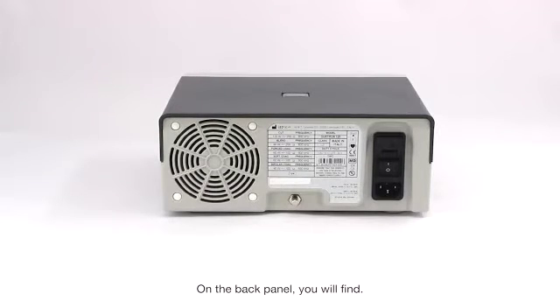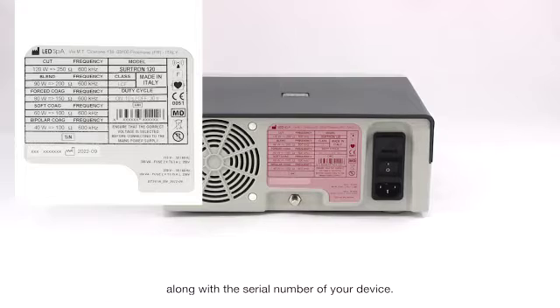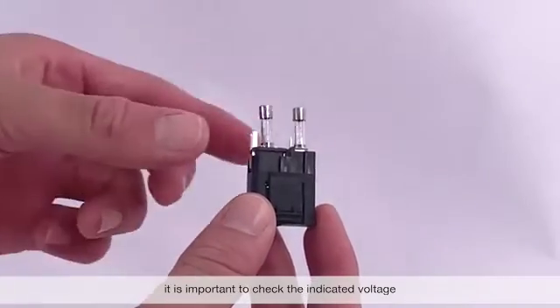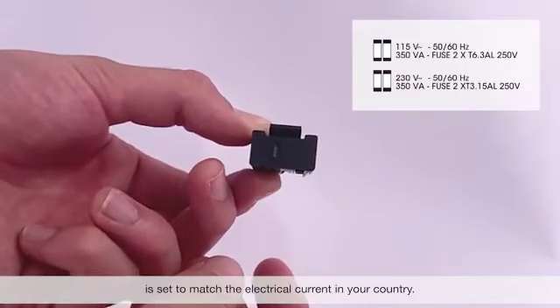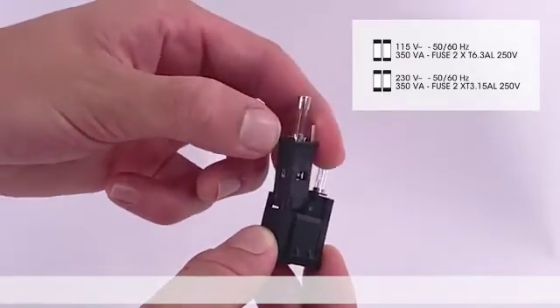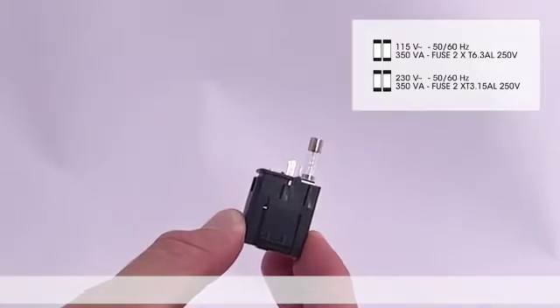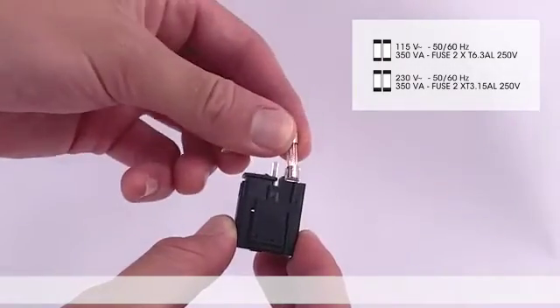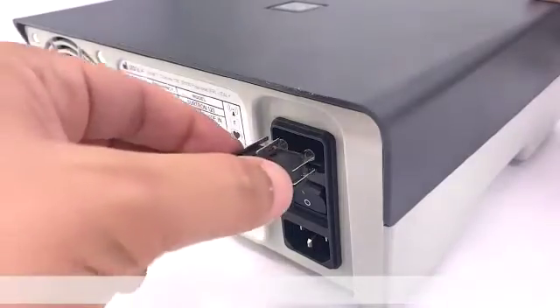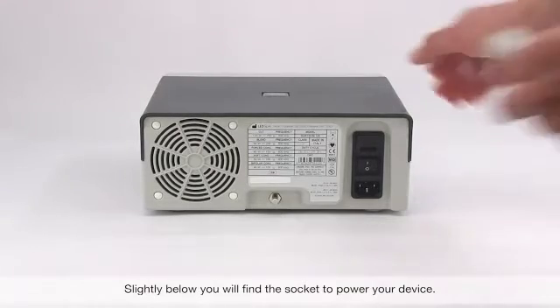On the back panel you'll find the white label with the max power level and corresponding impedance of each function, along with the serial number of your device. To the right is the housing for two fuses. It is important to check that the indicated voltage is set to match the electrical current in your country. Slightly below, you'll find the socket to power your device.